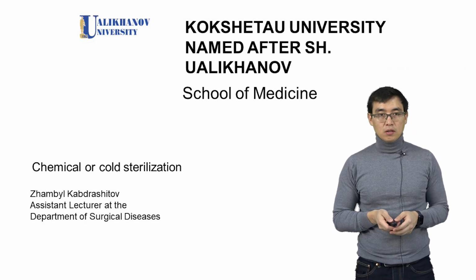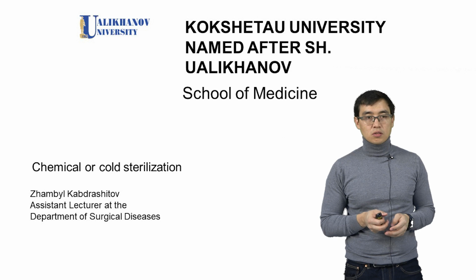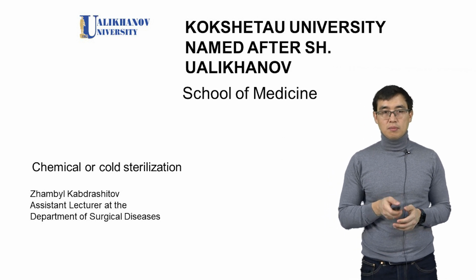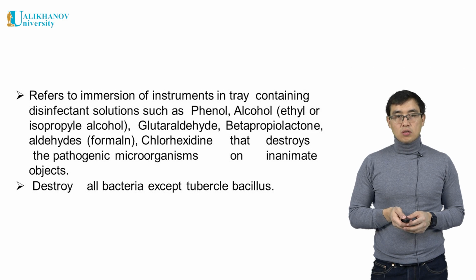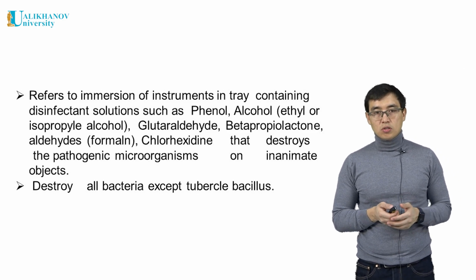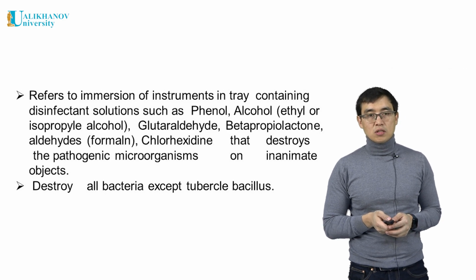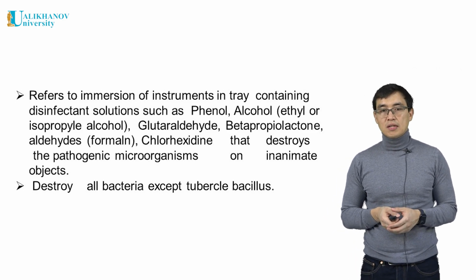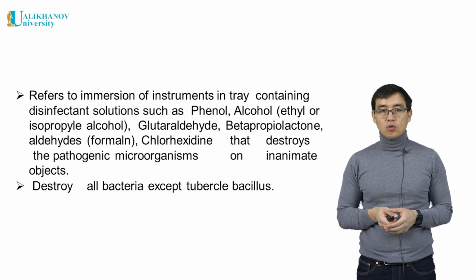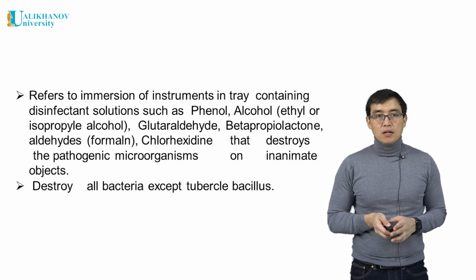So we continue our theme of sterilization. Another two types of sterilization are chemical and cold sterilization. This refers to immersion of instruments in a tray containing disinfectant solutions such as phenol, alcohol, and chlorhexidine that destroy pathogenic microorganisms on inanimate objects, destroying all bacteria except tubercle bacillus.